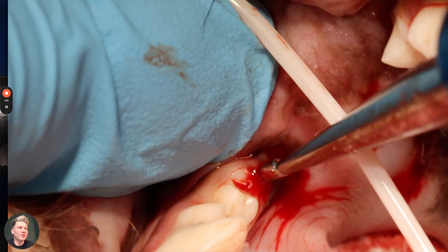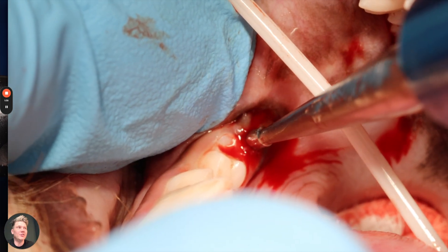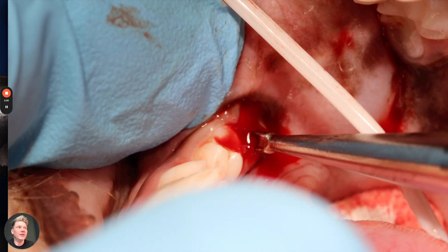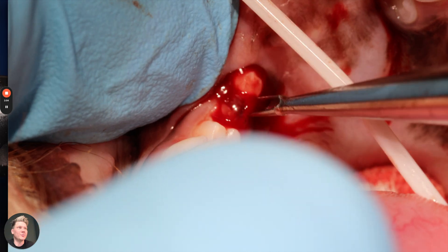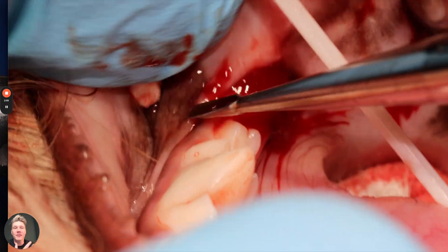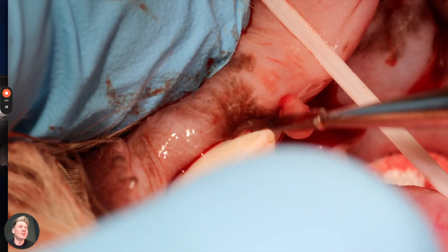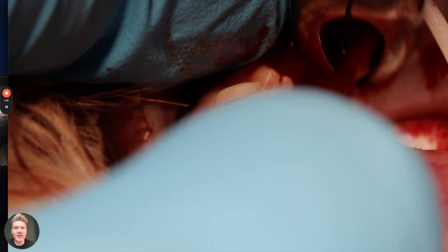As soon as you get inside, you start to see the tooth pretty quickly. I could feel it, and here it comes — it almost wants to pop out. While these dogs are young, these teeth are very easy to extract because they are so loose. I hope this video helped you with your next patient of an unerupted 4-0-11 or 3-0-11.